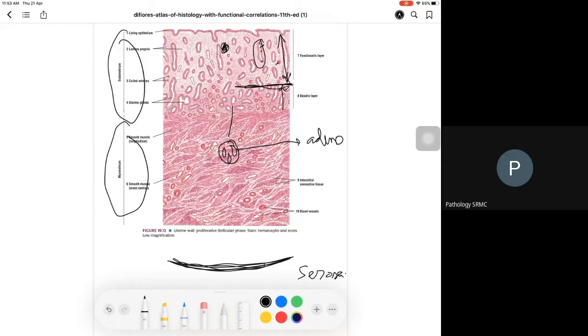So that shedding will produce a lot of hemorrhage, and so the definition of adenomyosis is presence of endometrial glands, endometrial stroma, and hemorrhage with hemosiderin-laden macrophages. This is the triad for the diagnosis of adenomyosis. When you see these three in the myometrium, it is called adenomyosis. When you see those three in the serosa or outside the uterus somewhere else, then it is called endometriosis. And this functioning layer, as you know, is divided into proliferative phase and secretory phase.